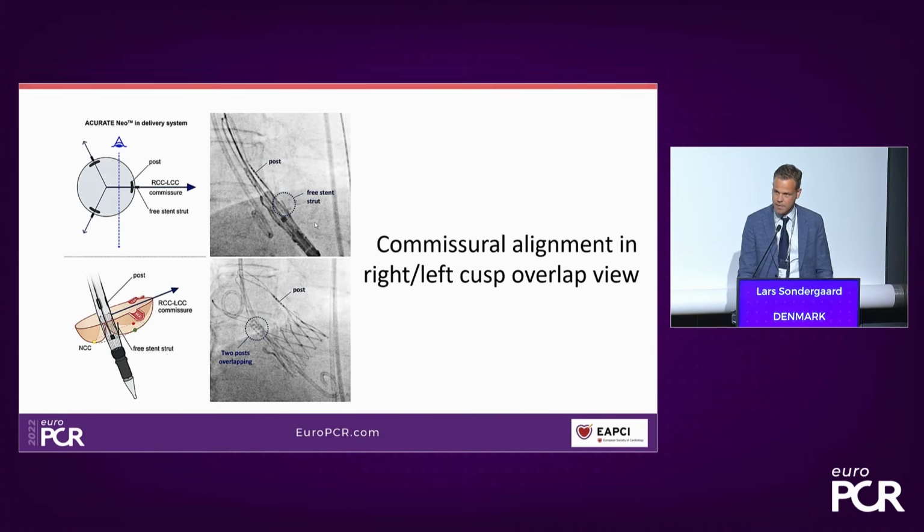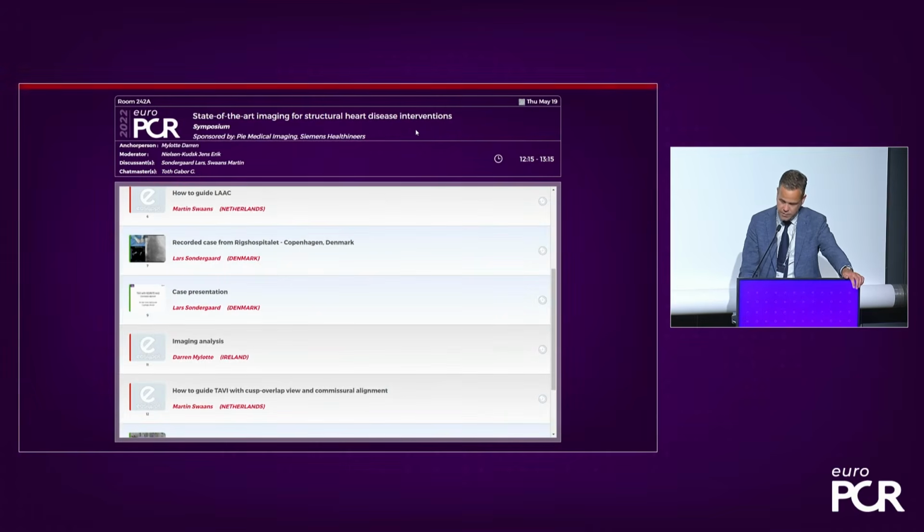So this can be nicely analyzed up front already with your 3mensio software, the angulation that you're going to use, and if it's not optimal, you just have to rotate. I think it's crucial for these patients to do.